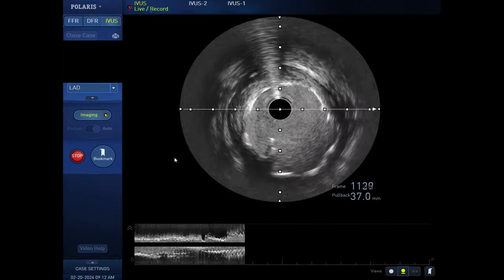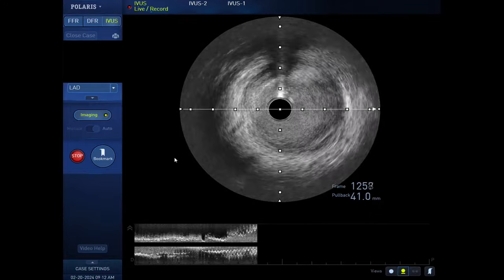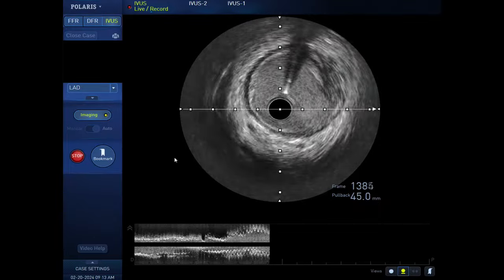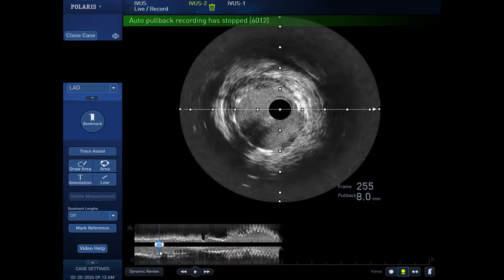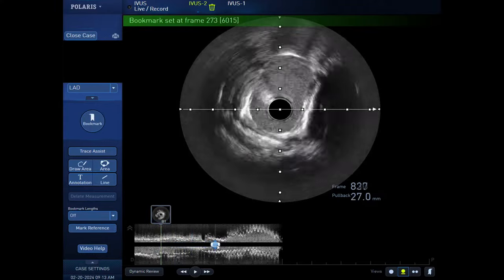Yeah, this is a D1. Nicely apposed, on the plaque but no malapposition. And a nice circular lumen. That's what the believers of POT claim, that they make a circular lumen rather than kissing, which is wrong. It's all done by theory, not in practice. So great results. Let's go to the completion of our presentation.